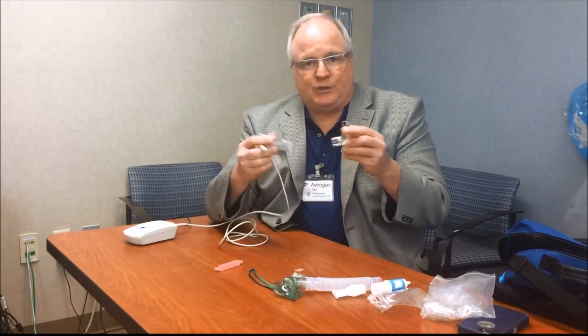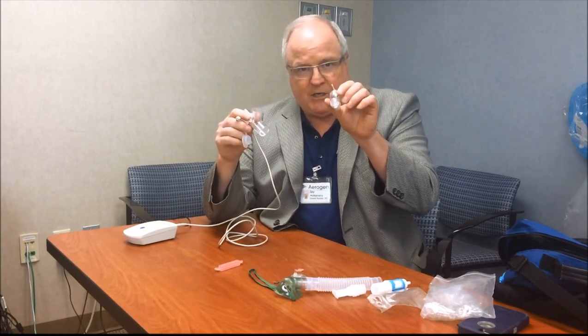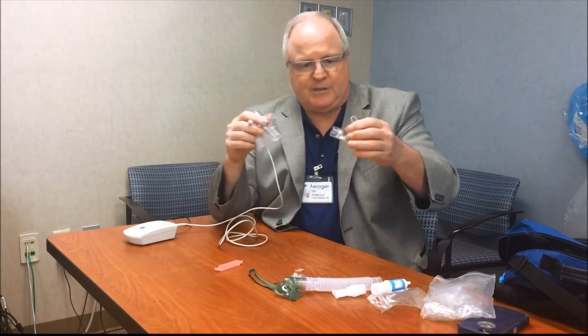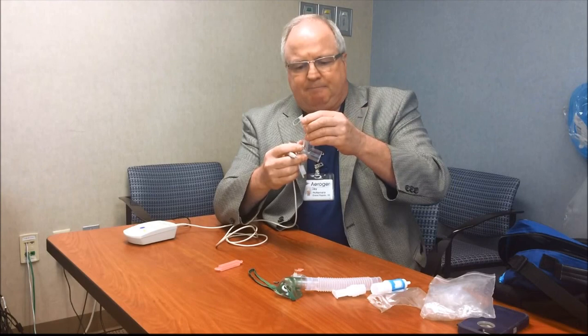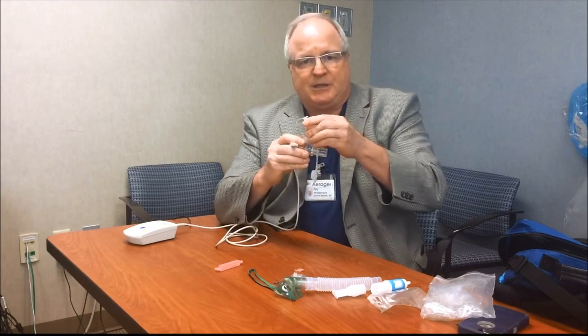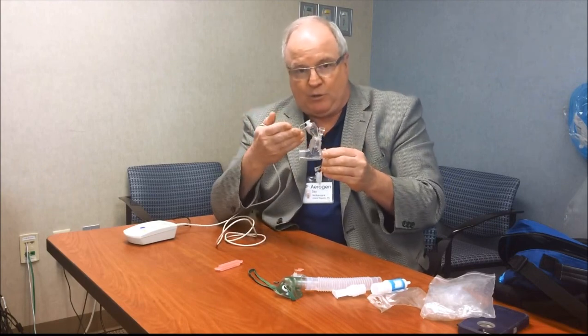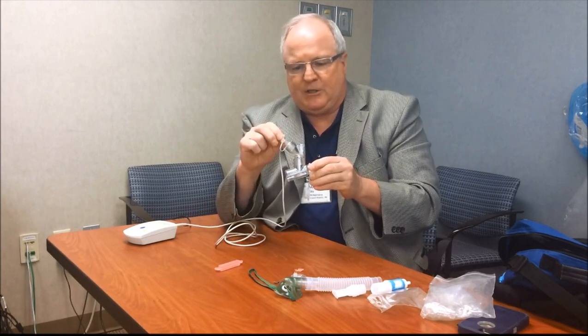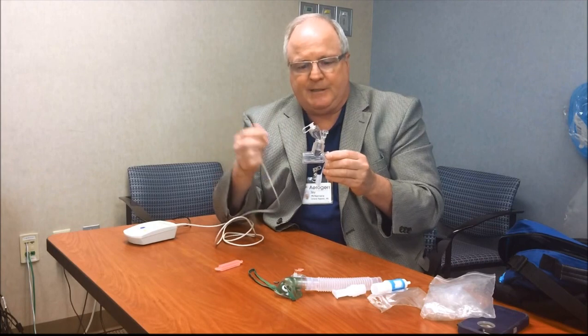For clinical use, essentially you have the vibrating mesh inside the Solo nebulizer, and if you look inside there you could actually see it. So the Solo, unlike a standard jet neb, sits above the circuit. So it does hold 6 mLs. You would basically open this, drop your medication in, close it, and turn the device on.